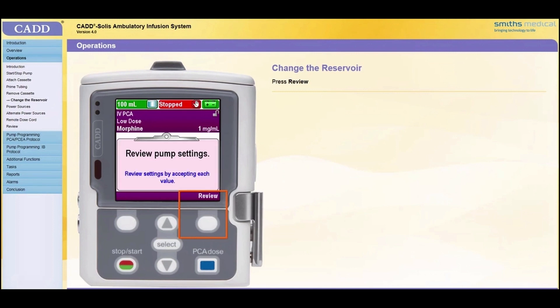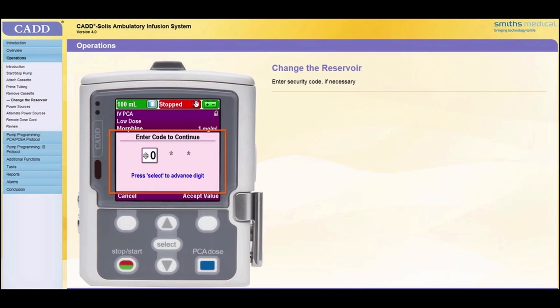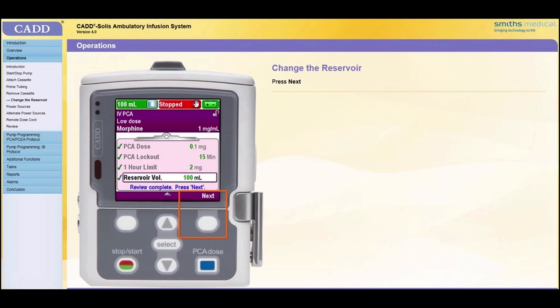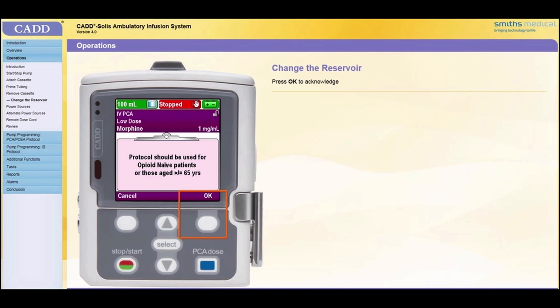The pump will prompt for a review of the delivery parameters since the reservoir volume value was reset. Press Review. If prompted, enter the security code as outlined in the overview module of this training. Review the delivery parameters and accept the values by highlighting each one and pressing Accept Value. When the review is complete, press Next. Review any clinical advisory note that may be entered for the selected protocol. Acknowledge by pressing OK.